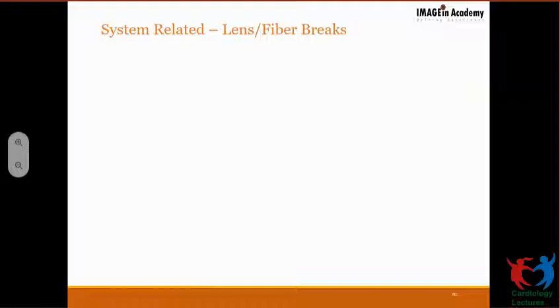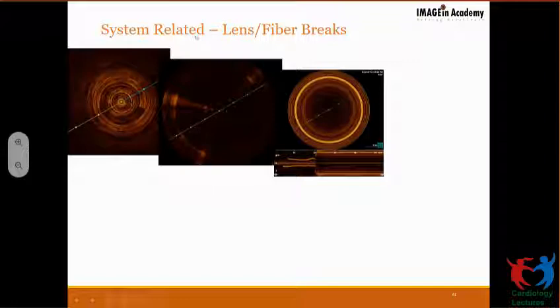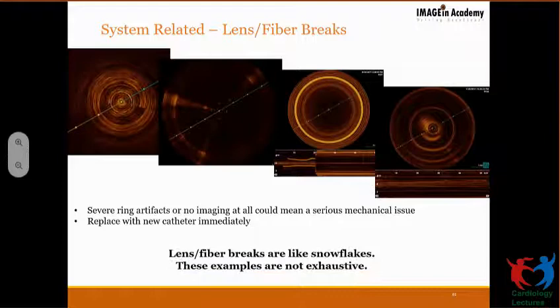Now these are things which can happen if you really damage your lens fiber or cause breaks. These are extreme. This is an extreme ring which is formed here. This is an extreme ring. So you kind of damage the catheter. If you see any of these things, please change the catheter. You need to change it, because you will absolutely not get any kind of image which will be interpretable. So replace it with a new catheter immediately, otherwise you are wasting your time.